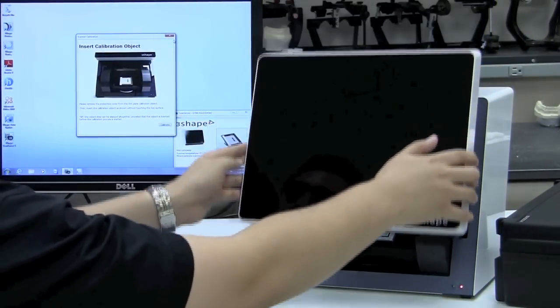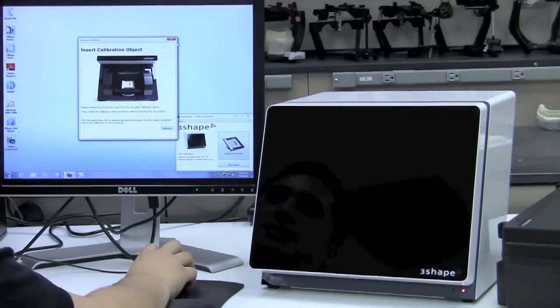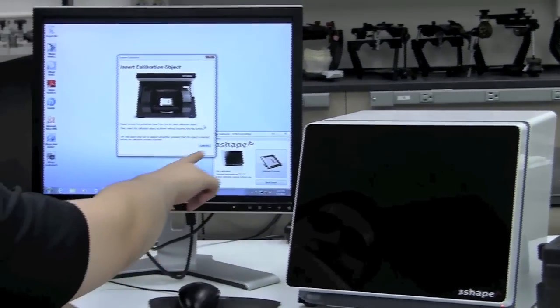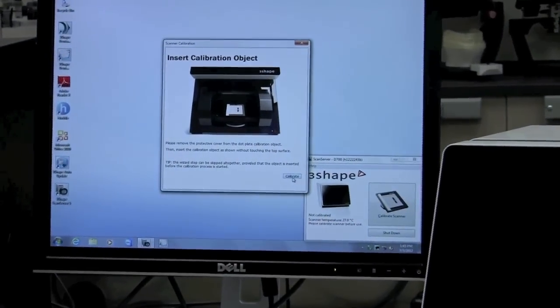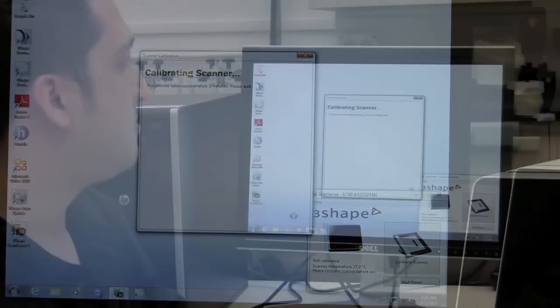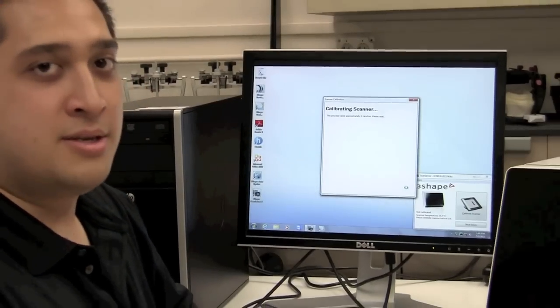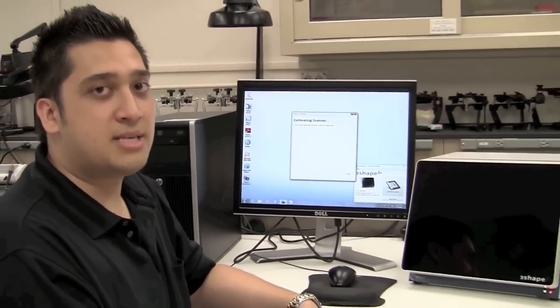Now that the calibration item is in place, we're going to go ahead and close the door, and the calibration will now start. Going back to the on-screen instructions, there's a small icon that says 'Calibrate,' so we'll just click that with our mouse to continue on. The scanner is going to run through its predefined motions, and this can take up to a maximum of three minutes.